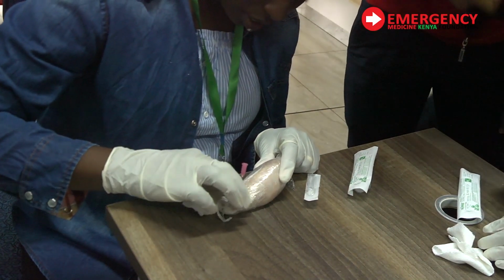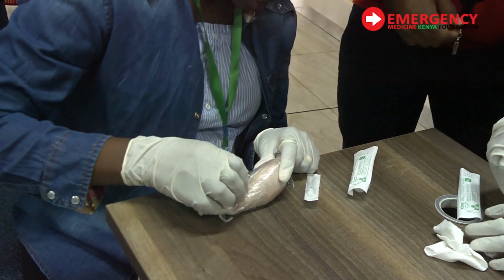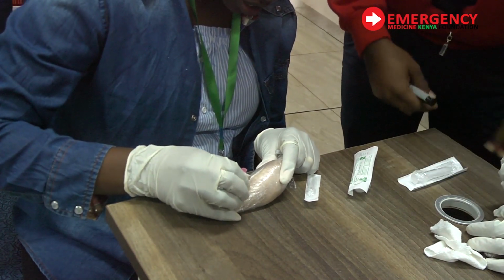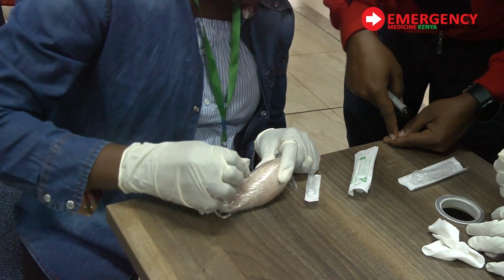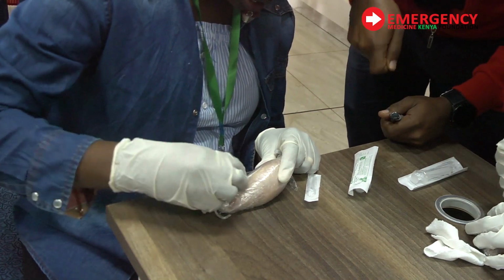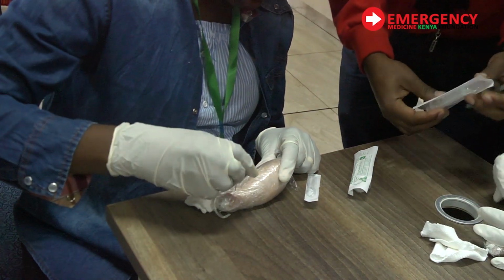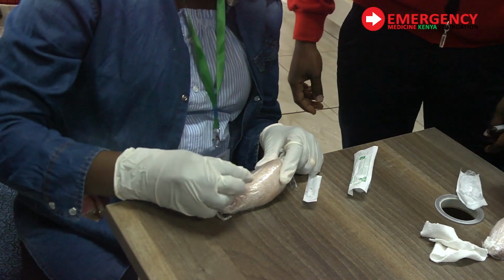Very easy. Very easy. We can do it. Are you volunteering? So please do it. We are recording as you do it. Successful. Congratulations. Without a gun? Very easy. Like I demonstrated, same technique.